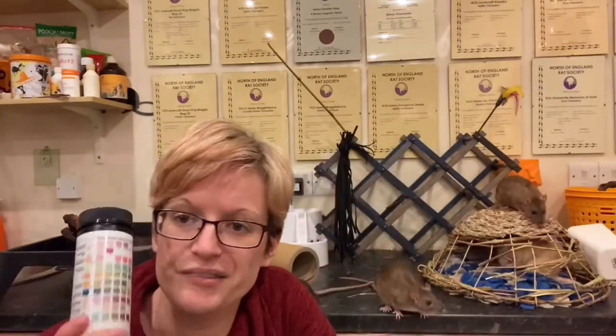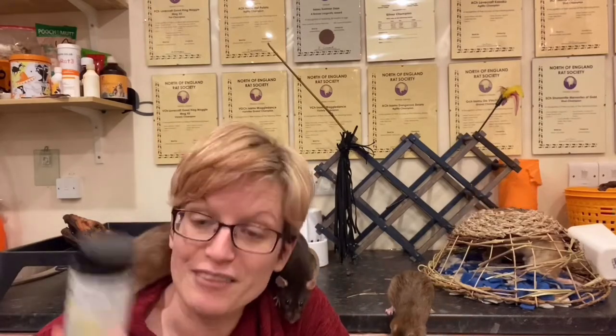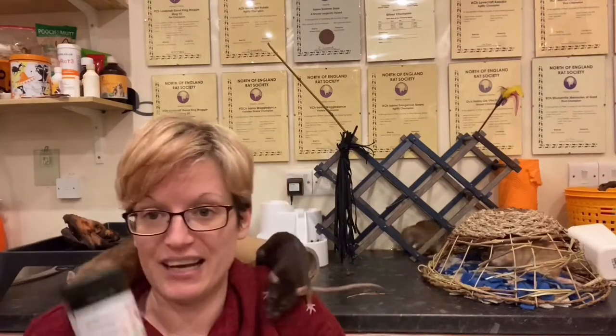These urine analysis strips are incredibly useful things to keep in the first aid box. When you spot something's not quite right about your rats, usually one of the first things I do is reach for the strips. So first of all, what are the strips and how do you get hold of them?